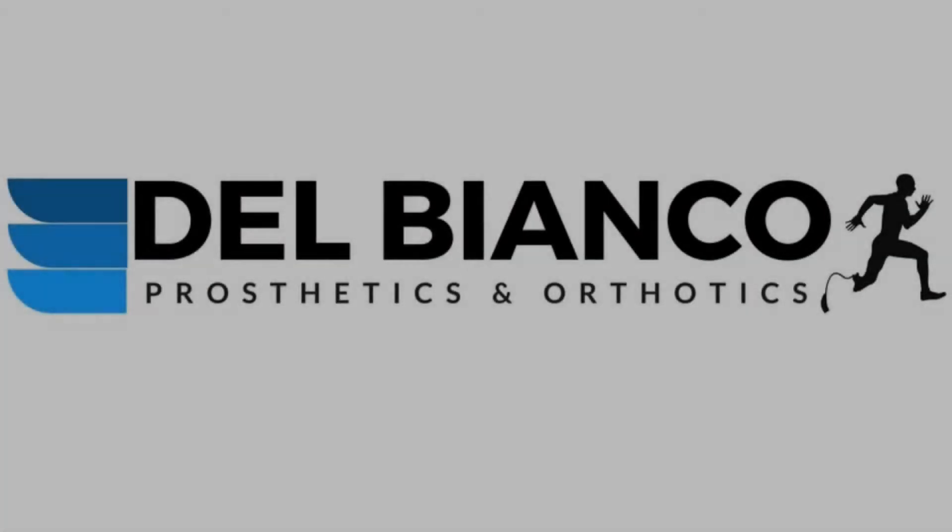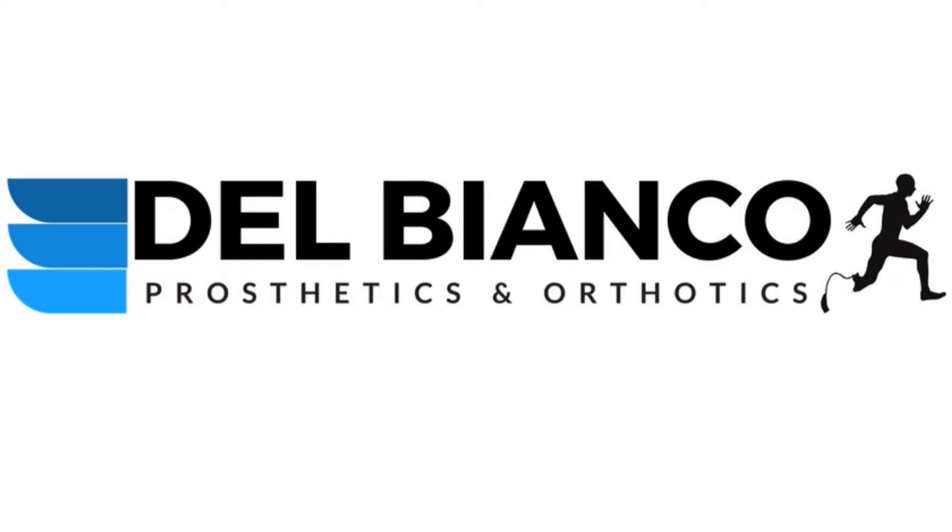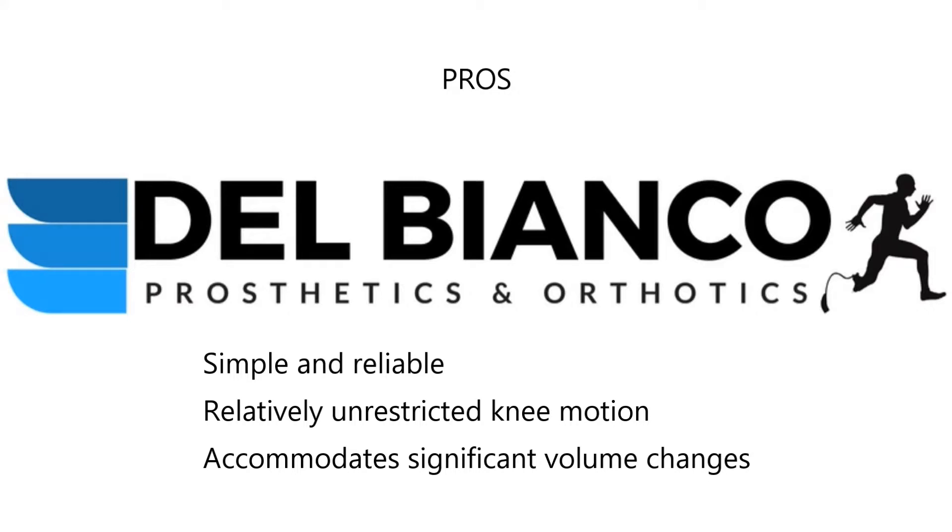Every prosthetic system has pros and cons. No perfect system exists and no one system works for everyone. Consider our additional videos for suction and vacuum prosthetic suspensions to learn more. Pin locking systems are easy and reliable. They have very little effect on knee motion compared to other systems and they can handle changes in limb volume better than most.